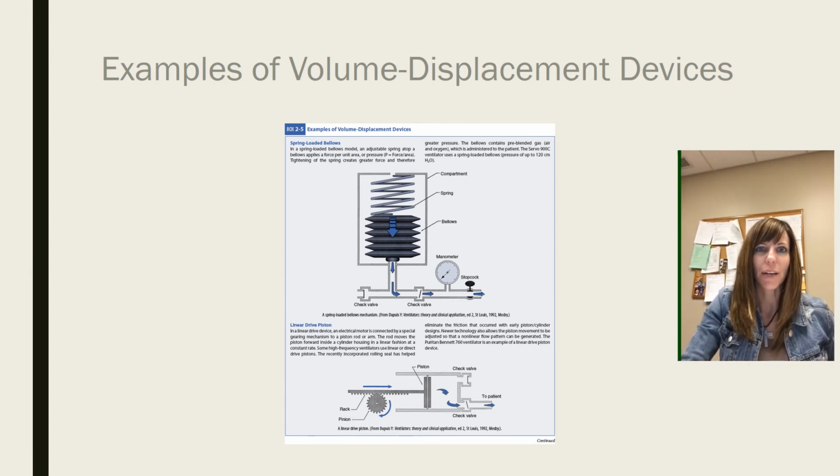But if you're looking at a soap opera or something like that from the 1980s, again, it would have something called an MA1, which uses a bellows to ventilate the patient. It's somewhat like bagging, I guess you could say. All you're doing is pushing air through like the bellows. I can show you an example in class if you don't understand it, but there's a picture in your book that shows it pretty well. It's the figure in box 2.5, if you want to look at that.